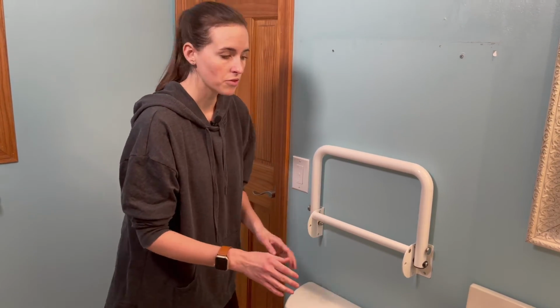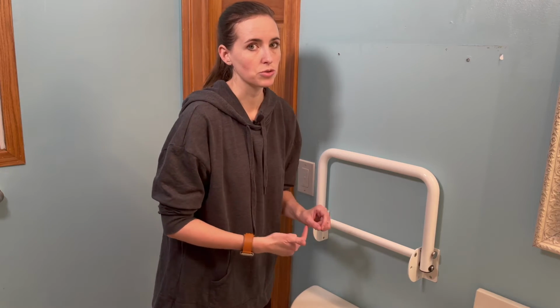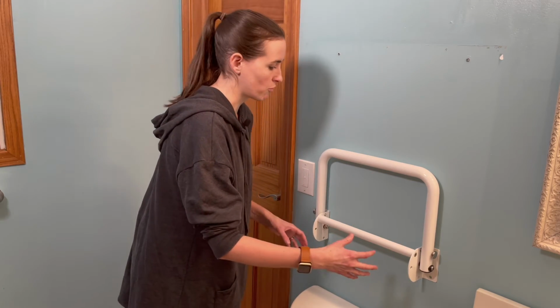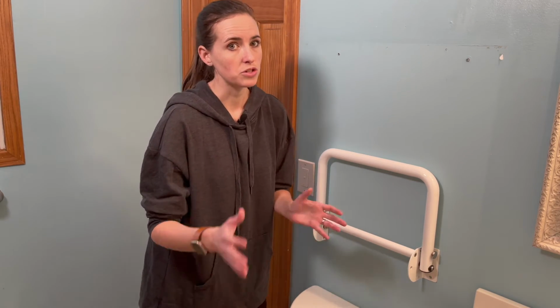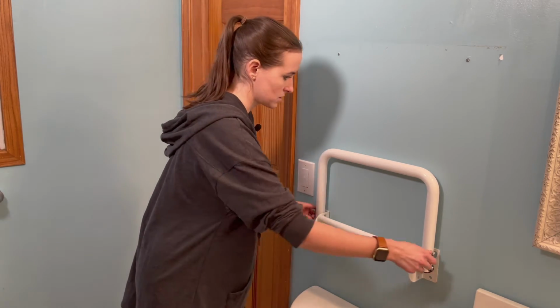I want to show you how this works. Now, a little bit of a note. This is not installed in its most secure form. I only put a couple of screws in just to show it in its demo version. So if you do install this, you need to make sure it's anchored properly. But for demo purposes, I want to show you this.